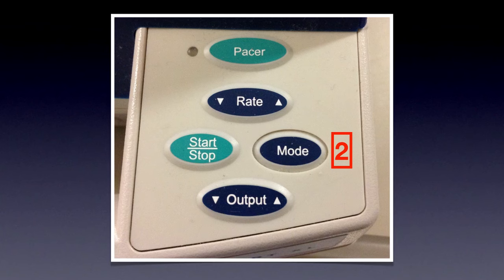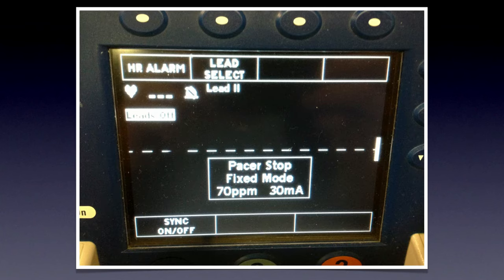Step two is to select the mode — fixed or demand. In fixed mode, the pacing system fires at 70 pulses per minute regardless of the patient's native rate — whether they're at 20, 50, or 100 bpm, it fires at 70. The transcutaneous pacemaker cannot sense and pace through the pads alone; it can pace through the pads but needs leads to sense. In fixed mode, all you need are the pads, since it doesn't have to sense. That means one less piece of equipment to set up.